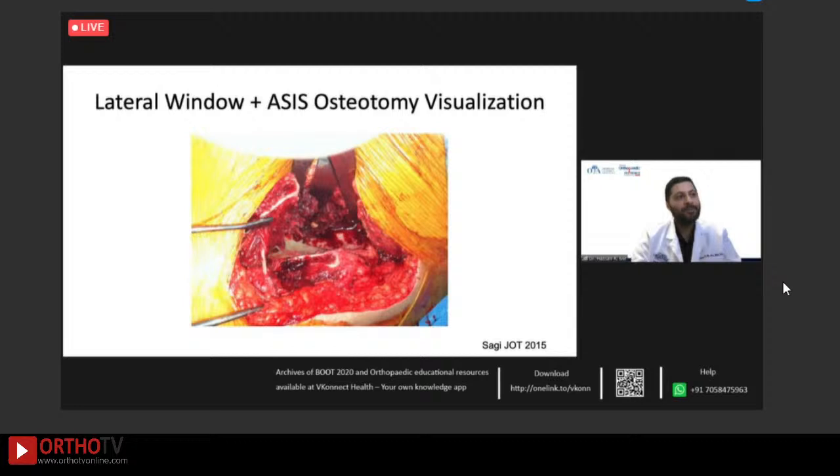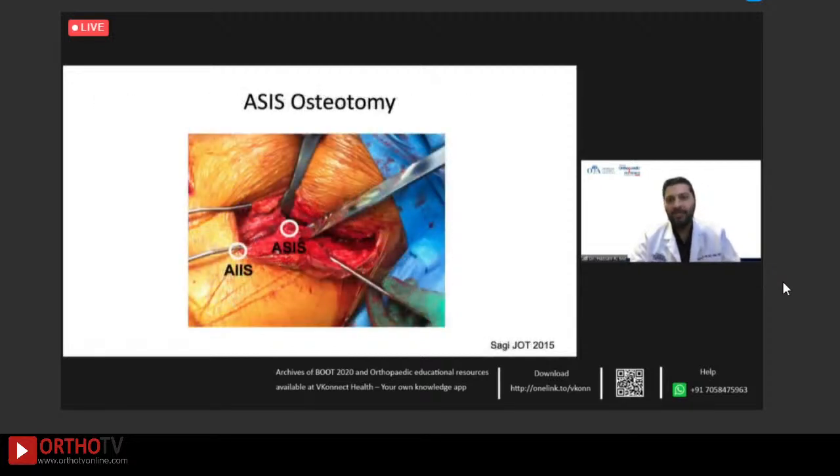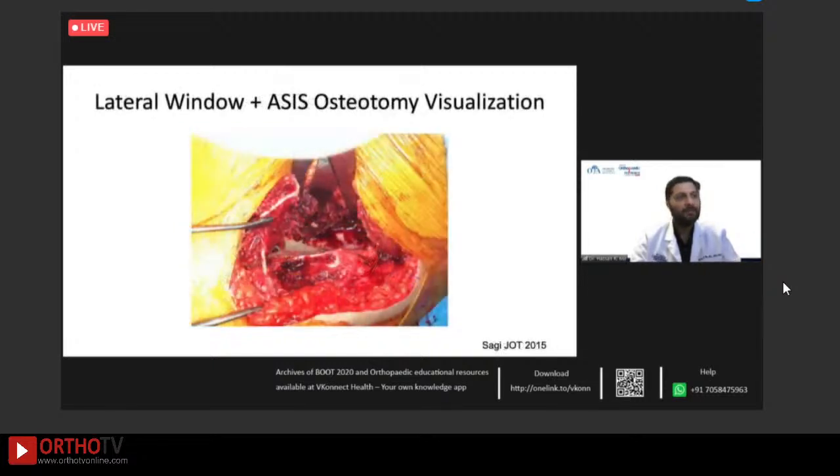So this just shows how much more visualization you can get. You can see this is without the osteotomy. You can't really see that well, and it's hard to get your lighting in and everything. But when you add the osteotomy, the entire hemipelvis just opens up. You can get to midline on the sacrum with the osteotomy. And then working anteriorly, you can get all the way down to the pubic root quite easily and work on any anterior wall and pubic root components of your injury. This essentially gives you clamp trajectories and implant trajectories similar to what you would get from a middle window of an ilioinguinal.